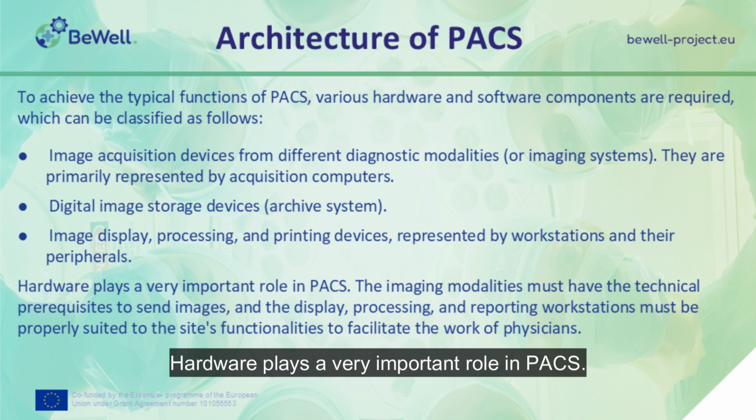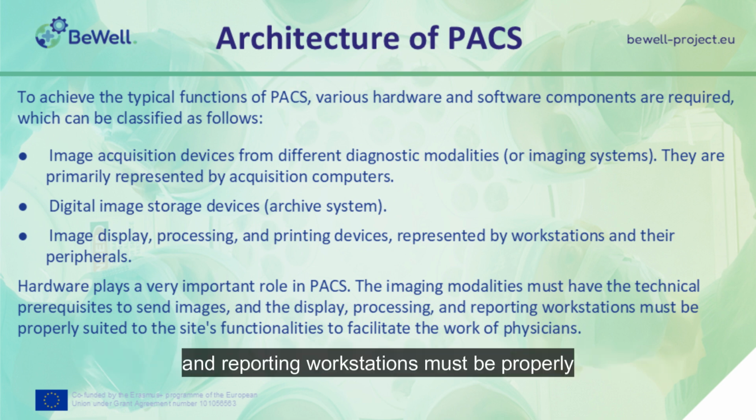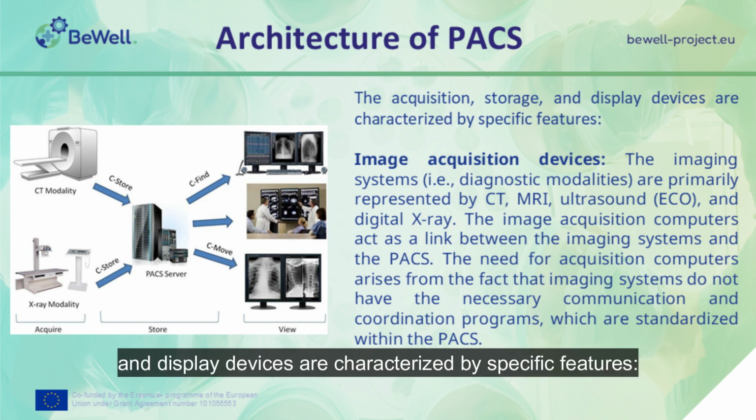Hardware plays a very important role in PACS. The imaging modalities must have the technical prerequisites to send images, and the display, processing, and reporting workstations must be properly suited to the site's functionalities to facilitate the work of physicians. The acquisition, storage, and display devices are characterized by specific features.